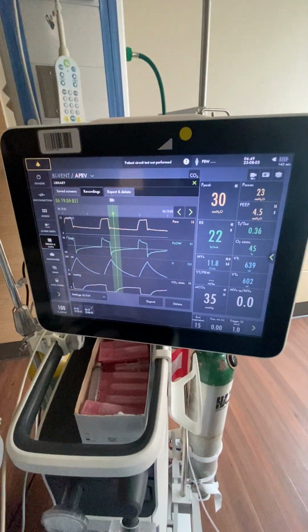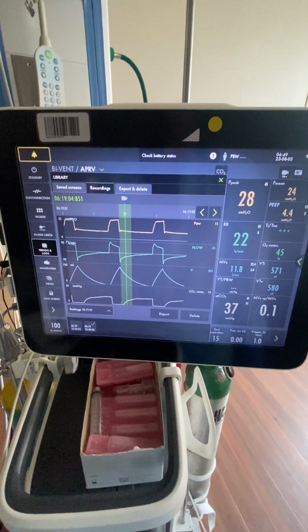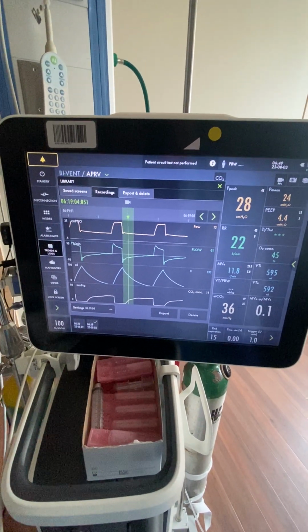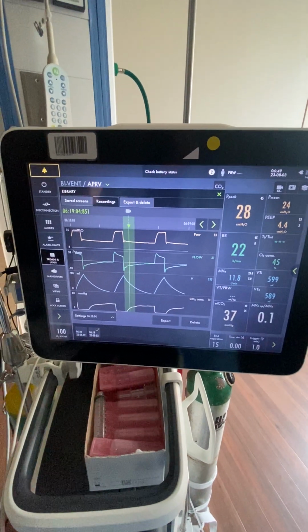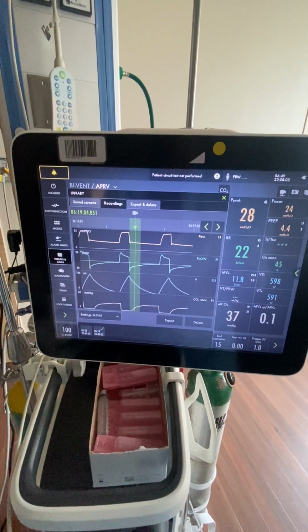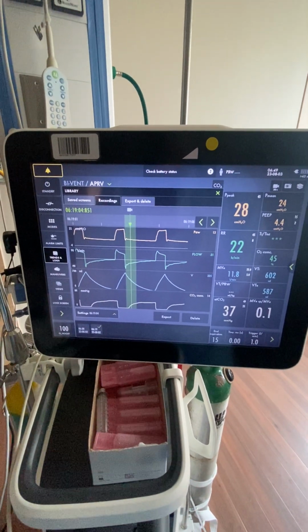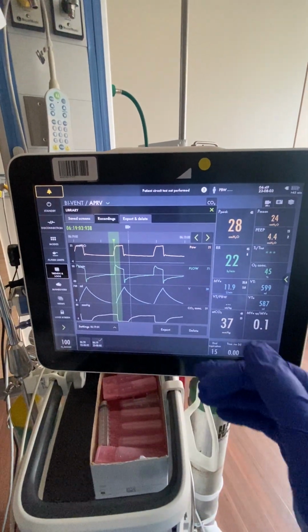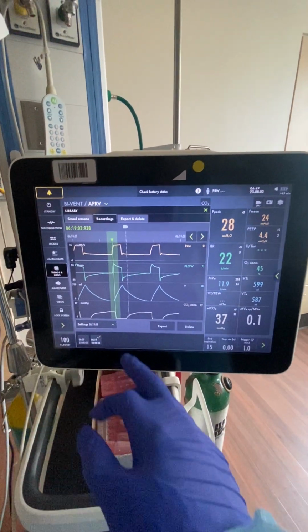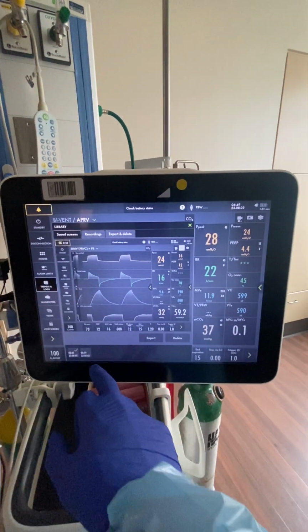Okay, so one of the biggest learning opportunities that I've seen for students is in the form of actual interventions with real life patients. This one is an intervention that I came into. I inherited this patient in a situation where we had a lot of airway resistance that was self-induced by some of the settings that we had.